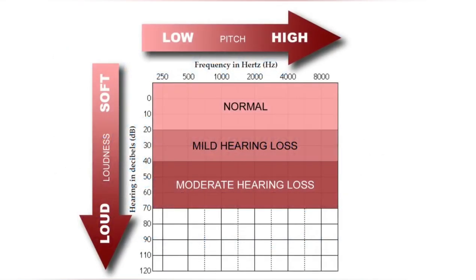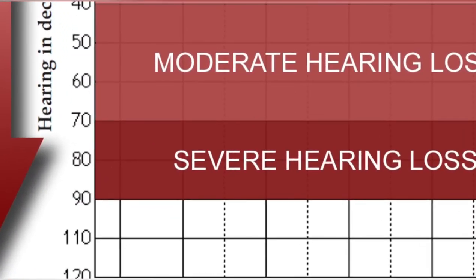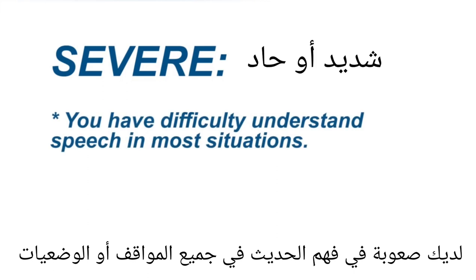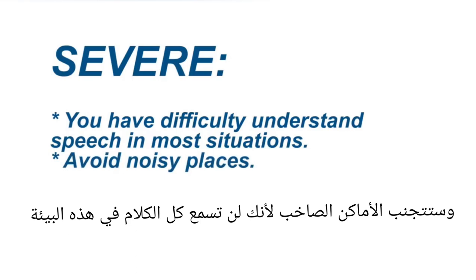If you have severe hearing loss, the X or circle will fall in the 70 to 90 decibel range. This means you are having significant difficulty hearing during most types of communication, and you may start avoiding noisy places where you know you will miss much of the conversation.